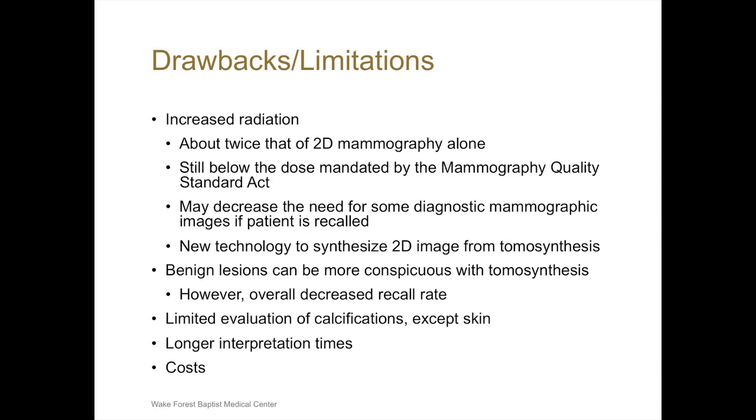And on our end, we see a lot of increased interpretation time. Studies have shown it takes about double the amount of time to read a 3D mammogram versus a 2D mammogram. This makes sense because instead of one image, you're looking at multiple 1 millimeter slices of the breast. And also, of course, everything comes at a cost.